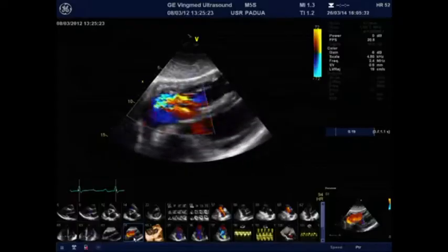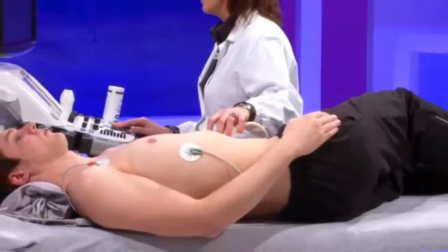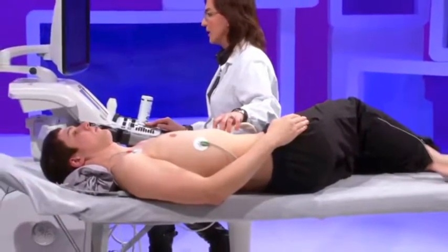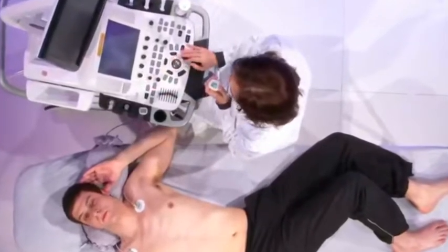However, all these views of the tricuspid valve have the problem that in each two-dimensional image, the tricuspid valve has only two leaflets that we can see, and we are not able to tell exactly which are those leaflets. So the identification of the leaflet involved in this case should be better done by 3D acquisition. So I would now switch the probe to the 3D probe, and then I will select the probe here. Okay.